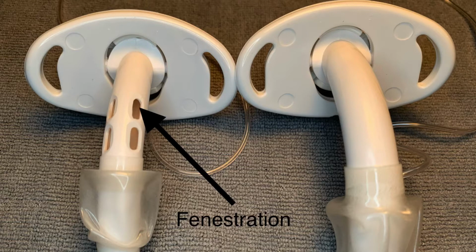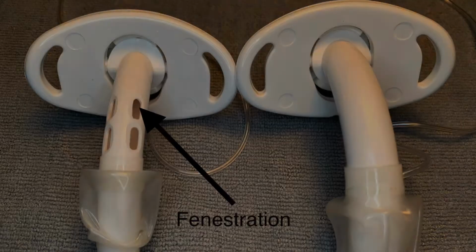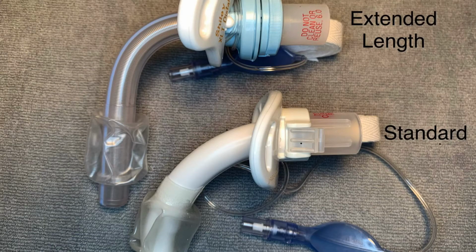Some have fenestrations or openings which allow additional air to flow through the voice box and mouth. Tracheostomy tubes vary in size based on patient size, and some non-standard varieties exist for patients with longer or thicker necks. Beyond this, custom tracheostomy tubes with different lengths and diameters can be created.